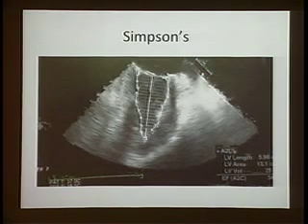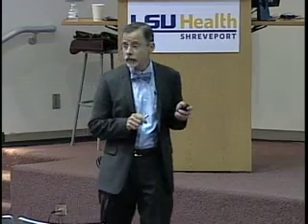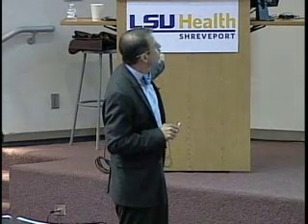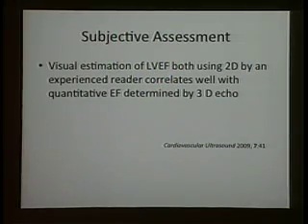Again, for one, you need to understand how they obtain the EF, how the cardiologist uses this, how you can be even more quantitative. I think when you move to the point where you're looking at the image and you get a subjective assessment of the EF, it's actually very elegant if you start getting some of this stuff like numbers, okay? And it takes very little trouble. Again, if you eyeball the EF, the correlation is there. It's been clearly shown. There are many studies showing this, so it's a reasonable way to do it.